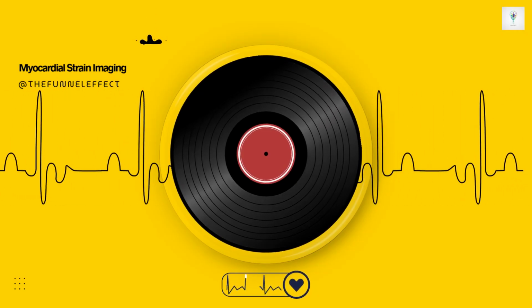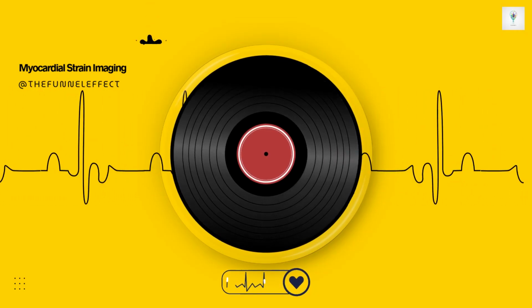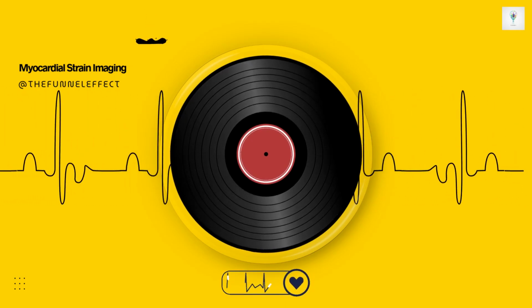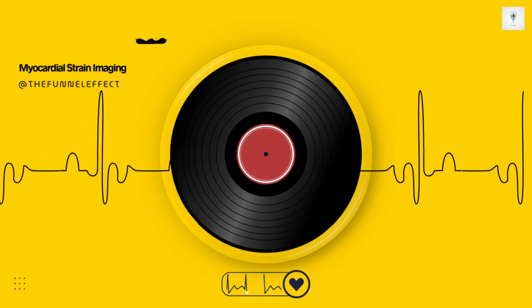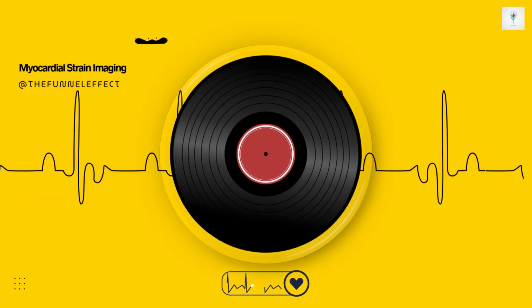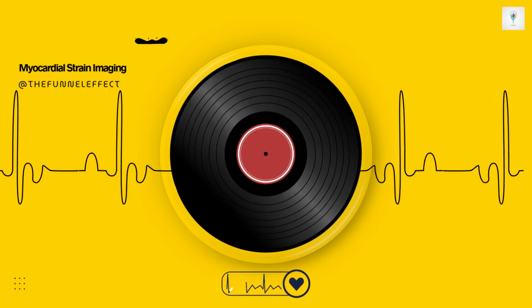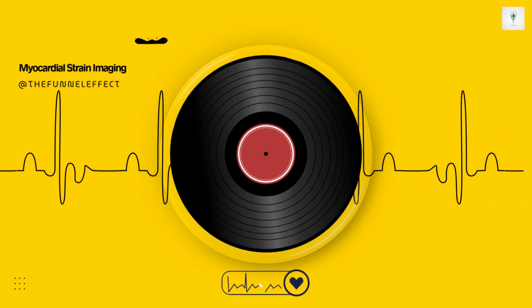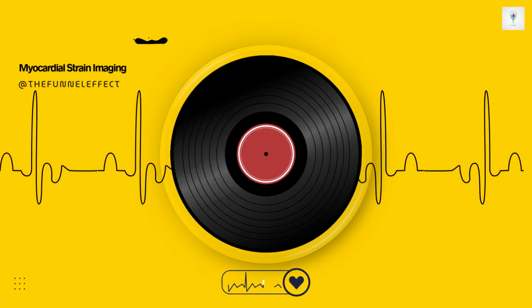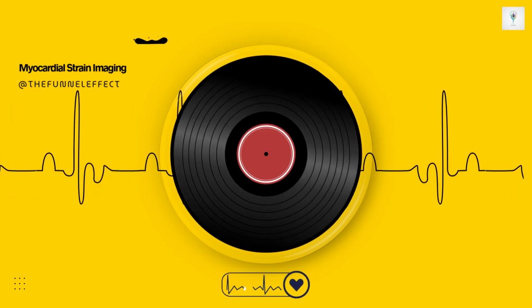While 40 to 50 frames per second is generally considered sufficient for measuring the peak systolic strain value, like the main GLS number, that frame rate is entirely insufficient for accurately measuring strain rate or for reliably analyzing those very brief high acceleration events like the isovolumic phases. So we lose some information compared to TDI. We lose the reliable strain rate information and the ability to precisely analyze very short-lived events.